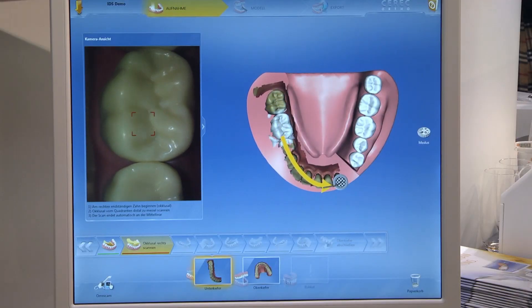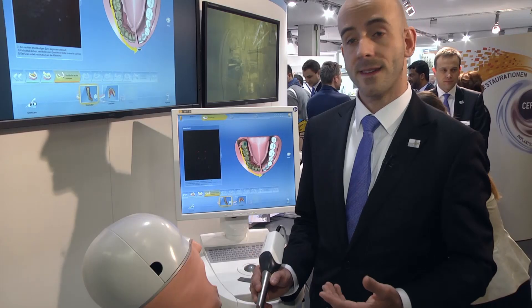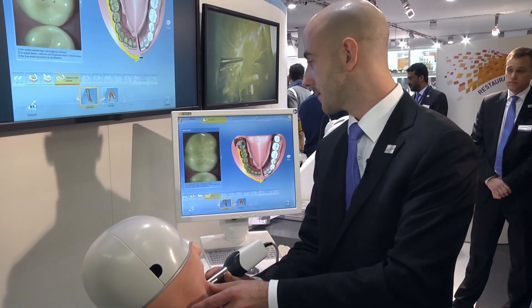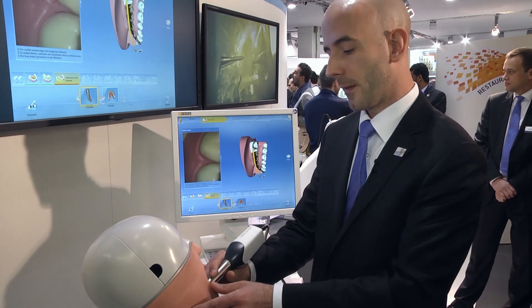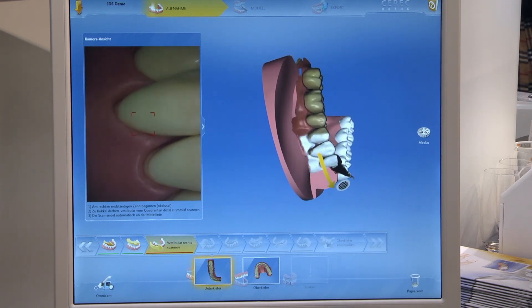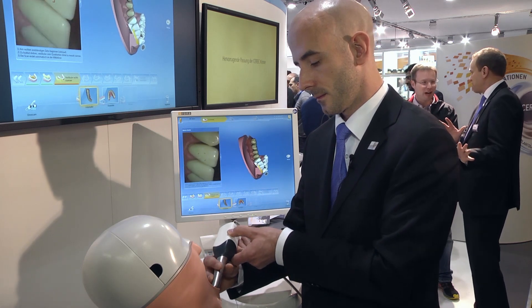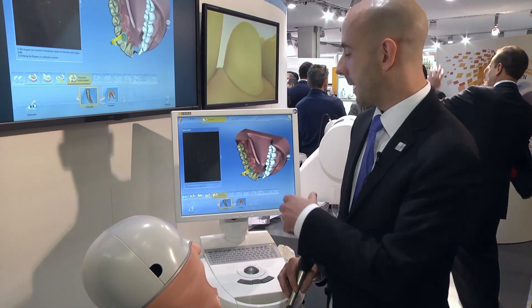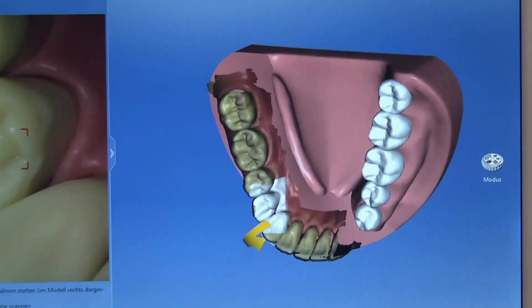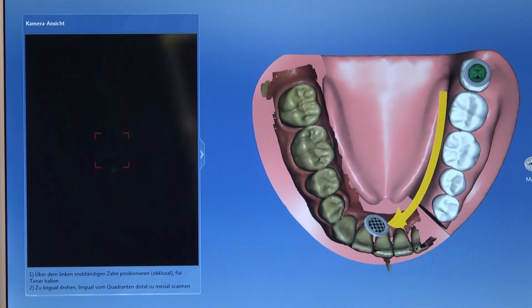We go back into the mouth and scan down the occlusal. That's done. Then we move on to the vestibular, again starting on that terminal molar occlusally. Now we've got those three scan steps in. We're going to tie these together with just a quick transversal sweep right across the arch. And that's how a quadrant is recorded.